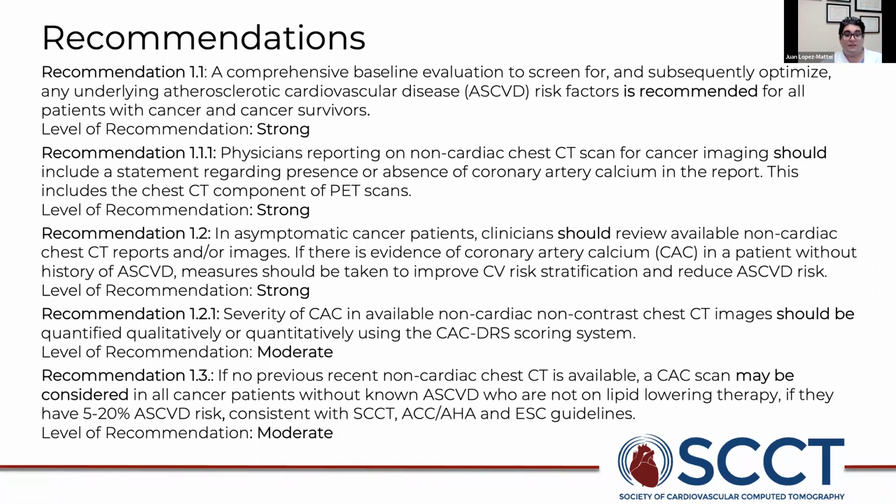Recommendation 1.2, in asymptomatic cancer patients, clinicians should review available non-cardiac chest CT scan reports or images. If there is even evidence of CAC, coronary artery calcium, in a patient without history of ASCVD, measures should be taken to improve cardiovascular risk stratification and reduce ASCVD risk.